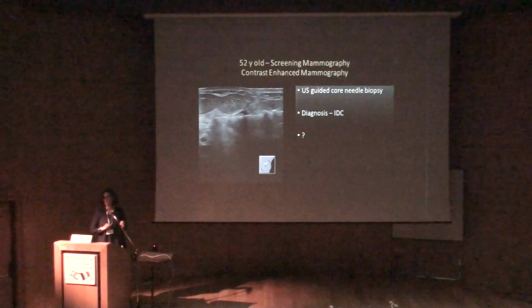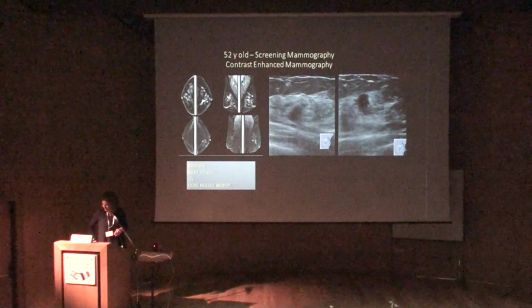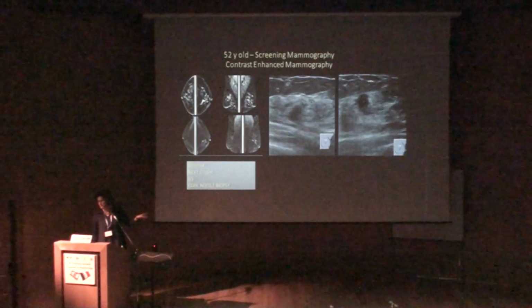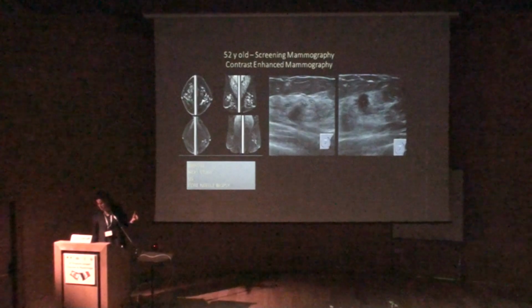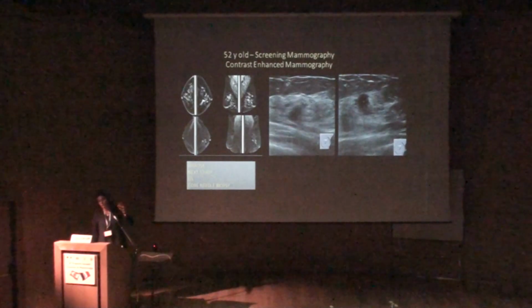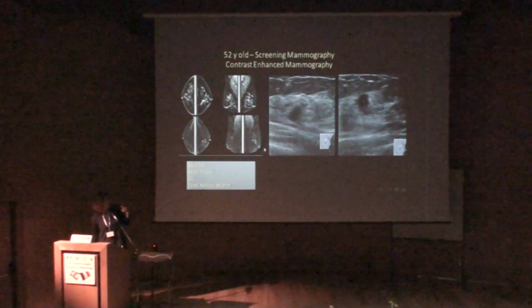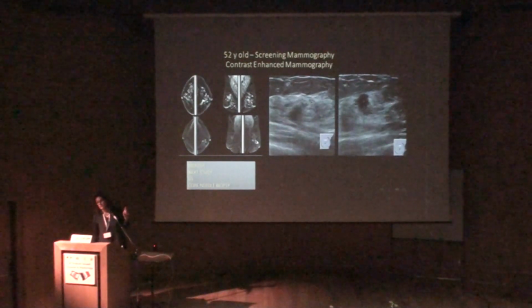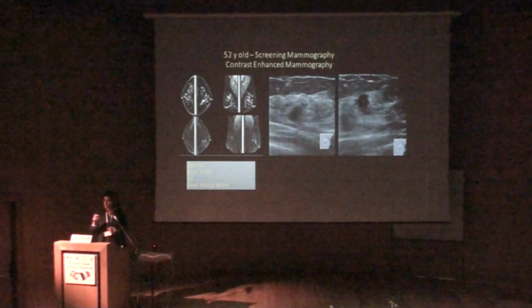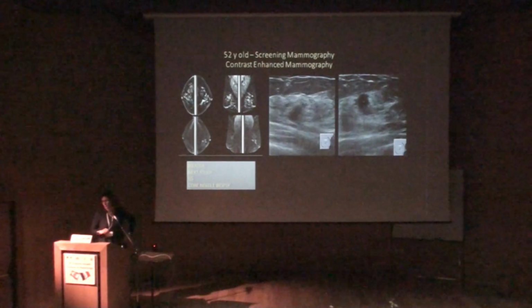Surgery, lumpectomy, mastectomy. Okay. Why do you say mastectomy? No, in her case, she comes from screening. Multifocal. Okay, but multifocal is when we have more than one lesion, but in the same quadrant. That's what she has. And the total distance of all those lesions is 3 centimeters, while each lesion is 1 centimeter. And I think it's possible to do a lumpectomy, but again, to do a localization of each one of the lesions, and then maybe to do a central lumpectomy.